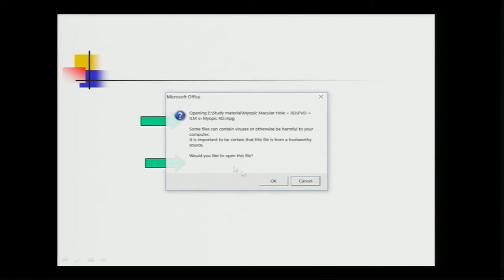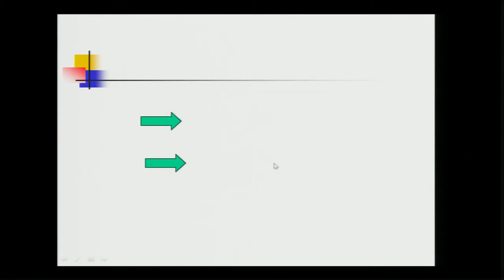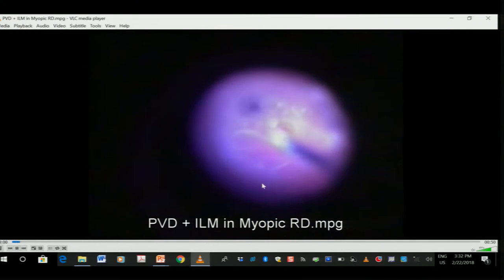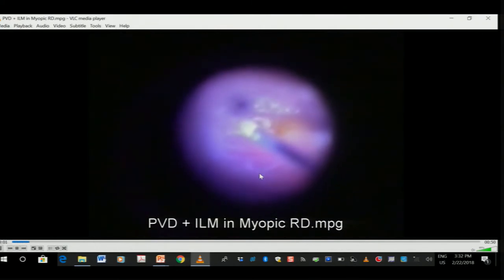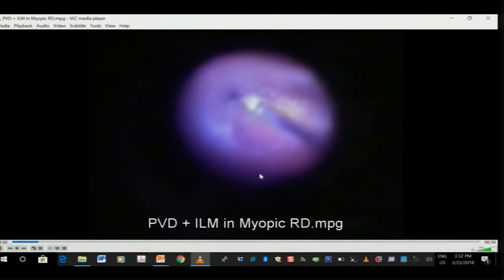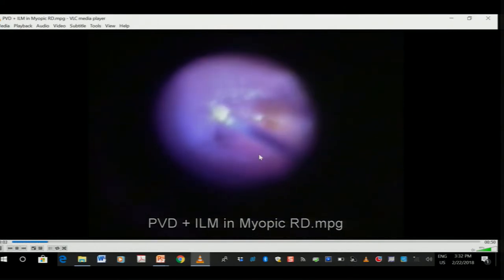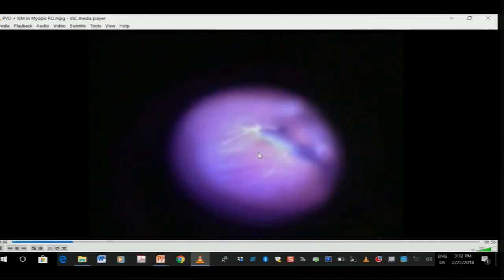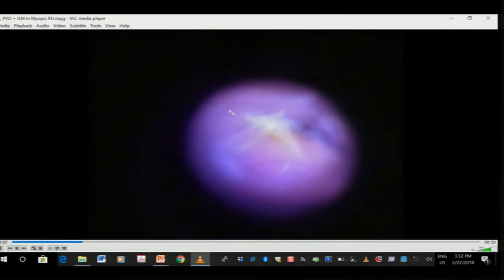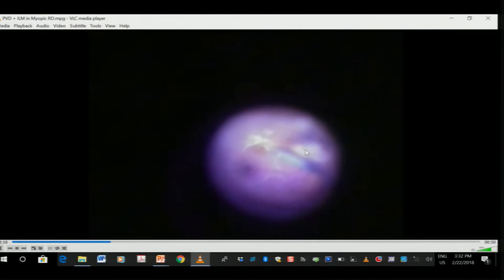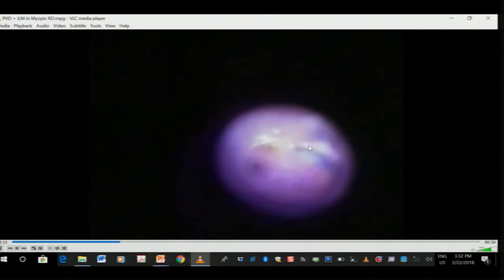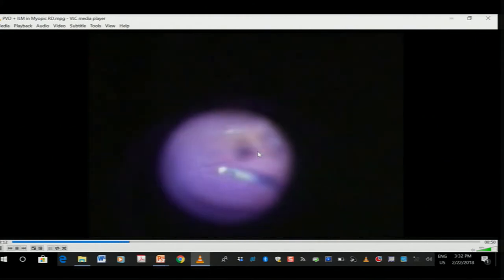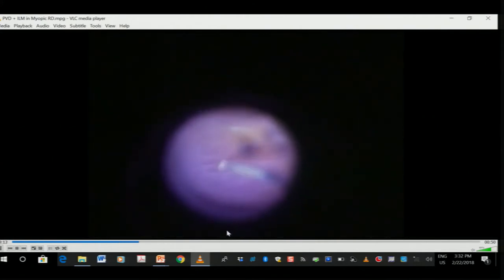This is one of my videos where the detachment of hyaloid was very tricky. In fact, it took 90% of the time detaching the hyaloid was so sticky. This patient had reg-RD, peripheral breaks, plus a macular hole, and it consumed virtually half of the time of surgery to peel off. We do not have ocriplasmin with us. I did use triamcinolone to delineate the plane. Triamcinolone has that property of getting adsorbed onto the vitreous gel.